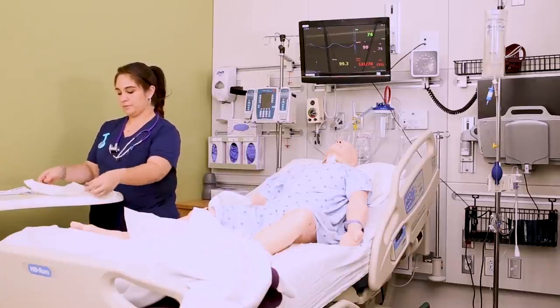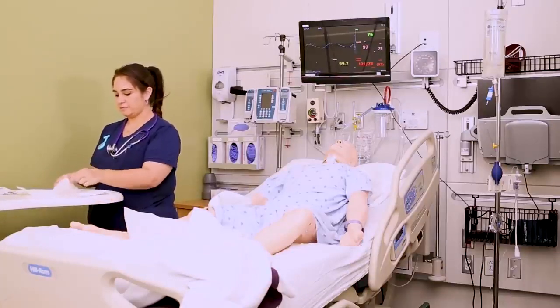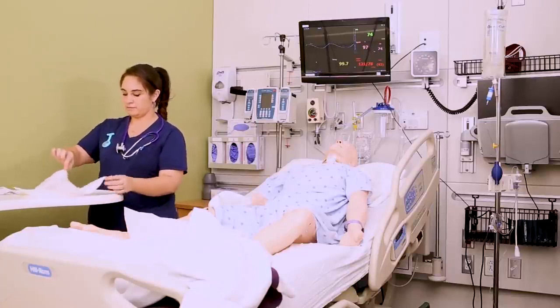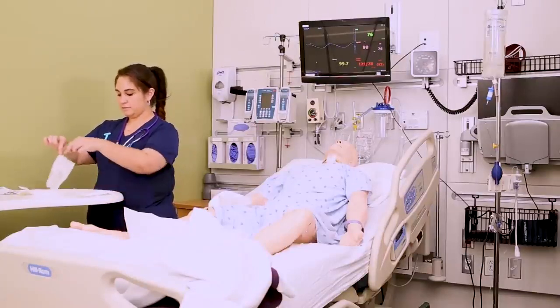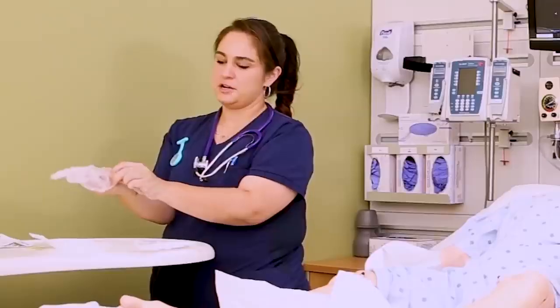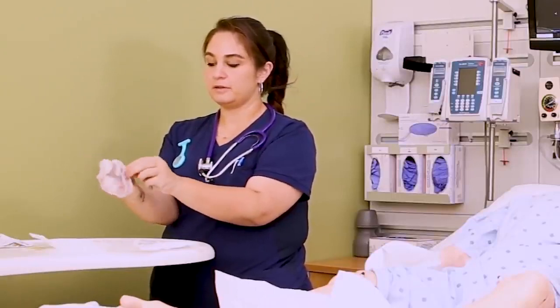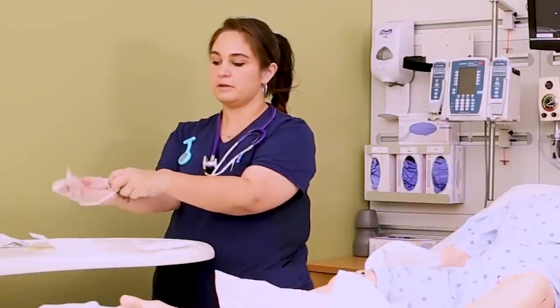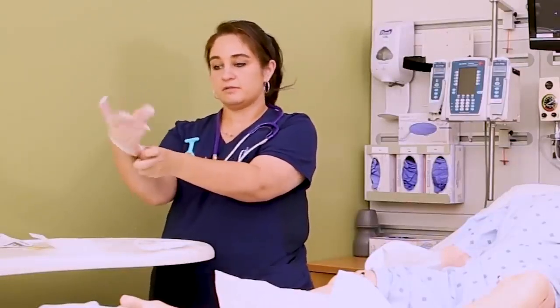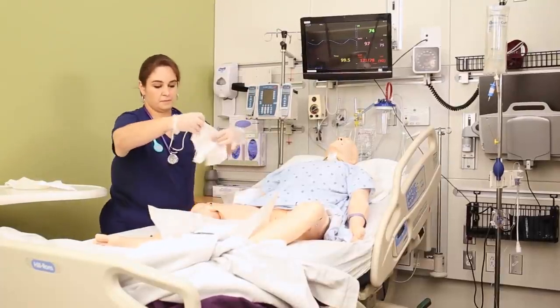The sterile kit should still be to your side and in front of you. If you need more details on how to put on sterile gloves, there is a whole lesson on that. The sterile gloves inside these kits can be a little tricky, so if you want to grab a separate fancier pack you can do that as well.